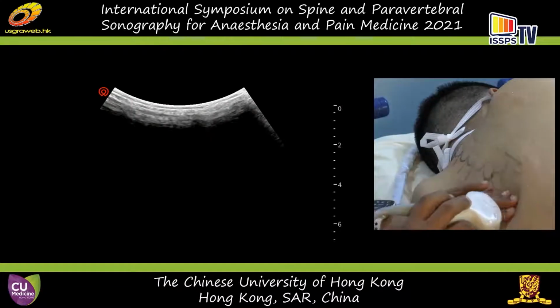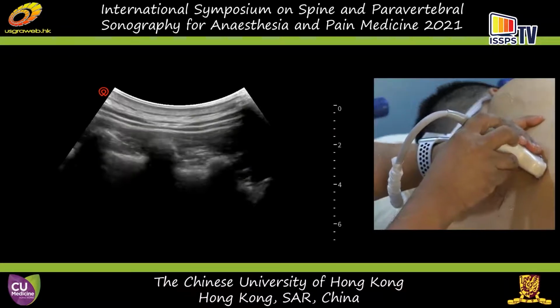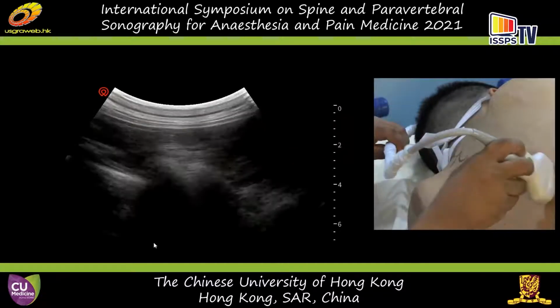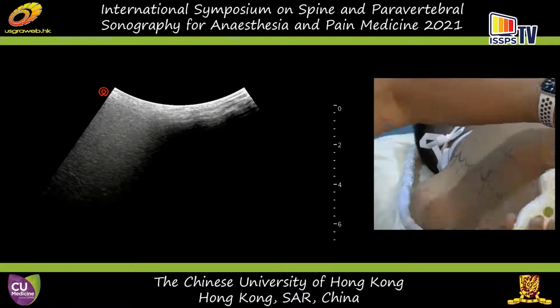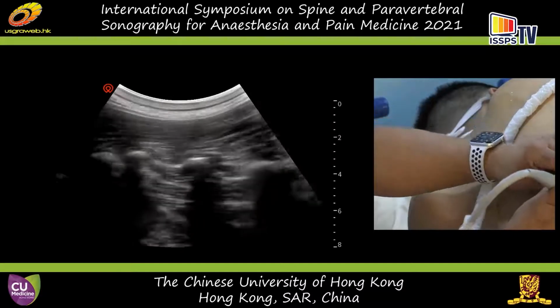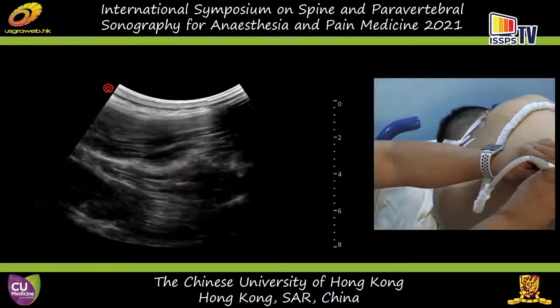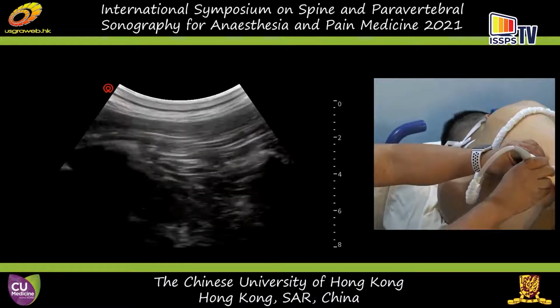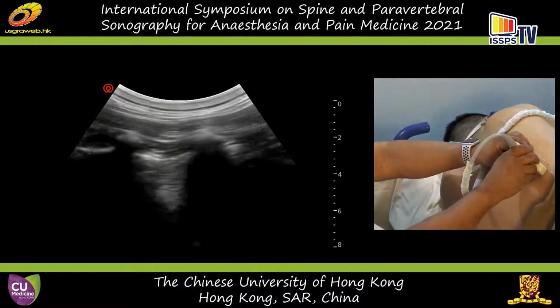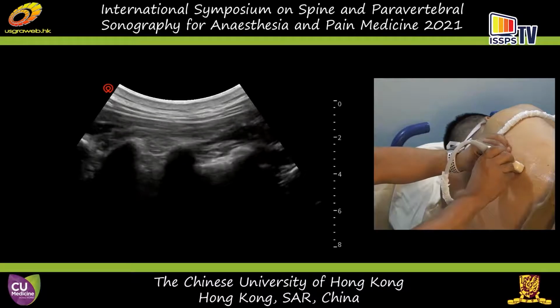Anyway, let's take a look at the lower thoracic space. You can examine the lower thoracic spine here, and we go from lateral to medial. You can see the ribs. We can actually go down and you can maybe find the 12th rib if you want. Caudal is to your right. So you can see here, we are actually looking at the psoas and the kidney, and we are going upwards until you see the 12th rib. So you can see the 12th rib, and here we go, 12, 11, 10, and 9. So let's go to 9 and 10.